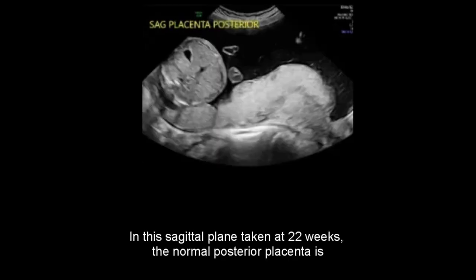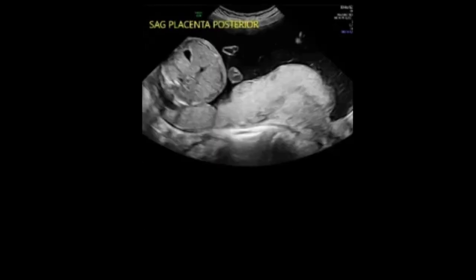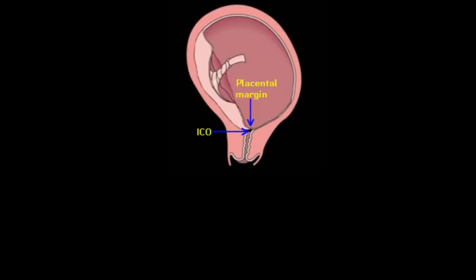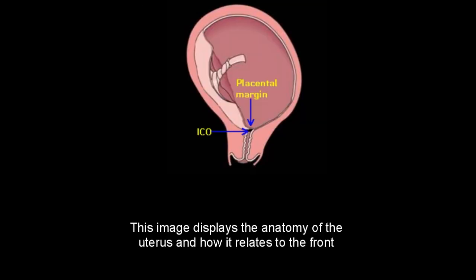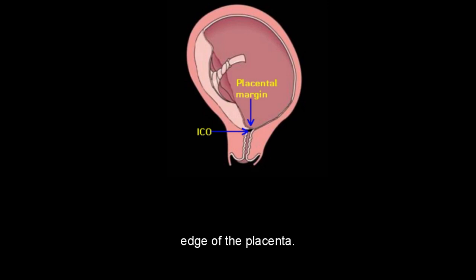In this sagittal plane taken at 22 weeks, the normal posterior placenta is associated with a uterine contraction. This image displays the anatomy of the uterus and how it relates to the front edge of the placenta.